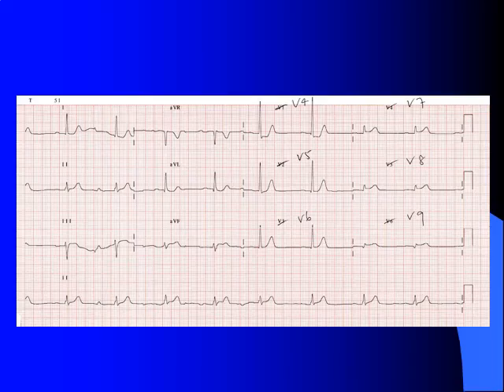And here's what our finding is in the acute posterior STEMI, when we have our ST elevation in V7, 8, and 9. That's our posterior side. Note that now we have some elevation there, whereas before we were just showing an isolated depression. So once we get to that back side where the infarct is actually located, we see the elevation. This isn't the case when we're looking from the front side, because we're looking at that mirror image through the rest of the myocardium to see that infarct. So we have to move it around to the posterior side.